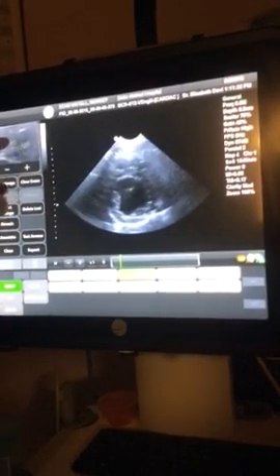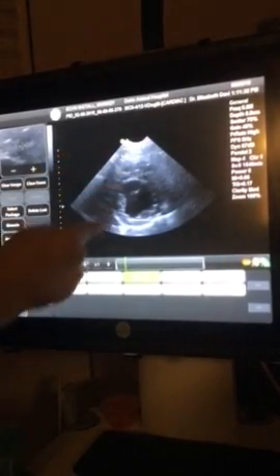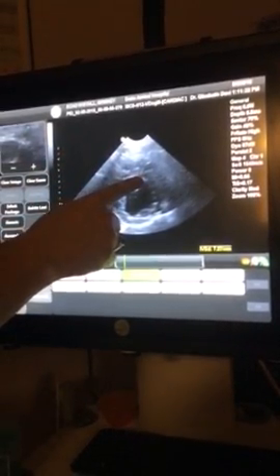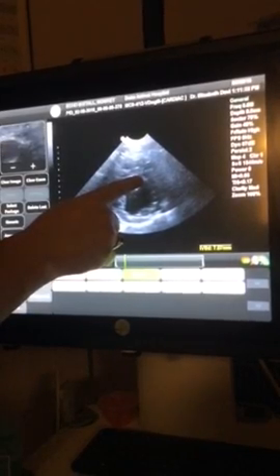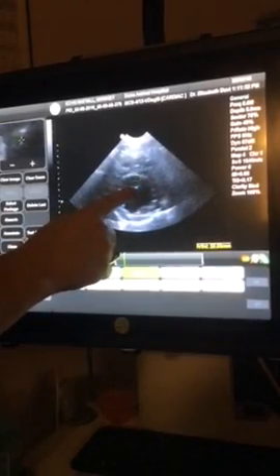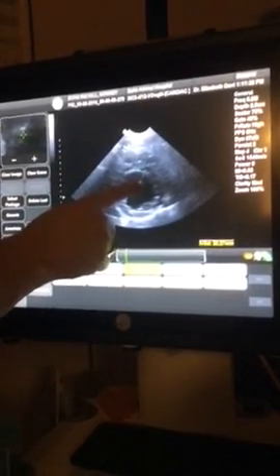You make your adjustments from up here. You want to keep your line coming down consistent, just like if you were doing M mode there, so you'll touch and drag that caliper. You can use your left upper zoom box to look at that caliper. Don't take your finger off until you're done, because once you take your finger off, no matter where you are here, it's going to think you're done and take you to the next measurement.